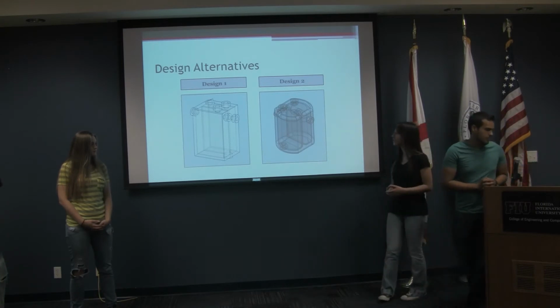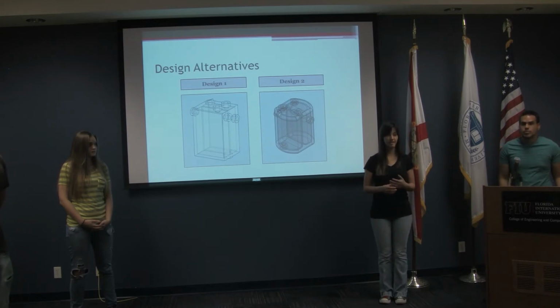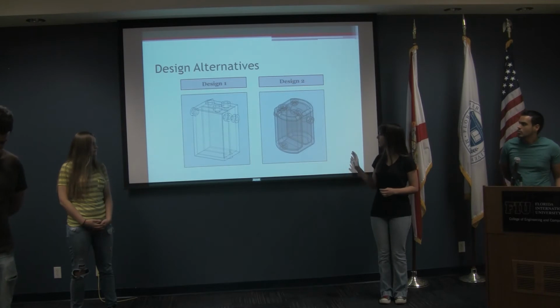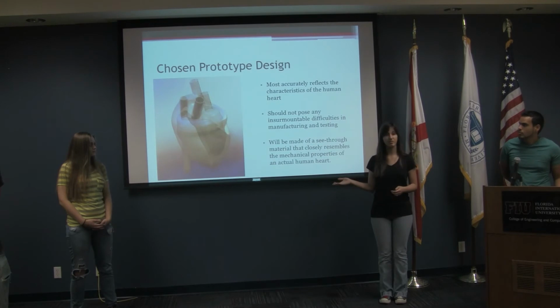Alright, bearing in mind that CAD simulations take longer and become less reliable, and prototype production becomes more costly and more complicated with the more features that you add, we started with very simple rectangular box shapes. The flow was obviously completely wrong on the first one, so we tried to model the wall thicknesses more accurately. We more accurately placed the valve placements, and we filleted all of the edges, but the flow still wasn't behaving the way we hoped. So this is a 3D rendering of the model that we actually designed in CAD.